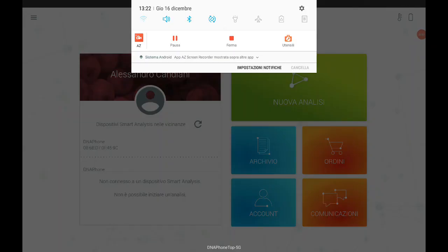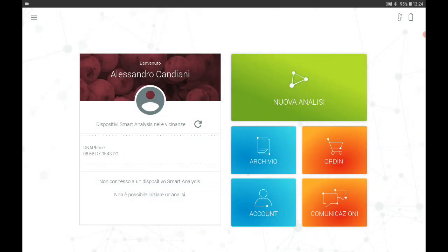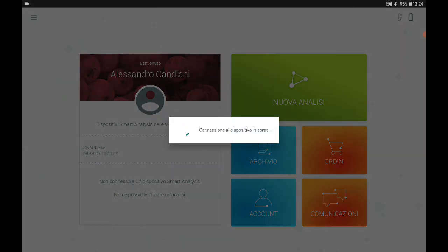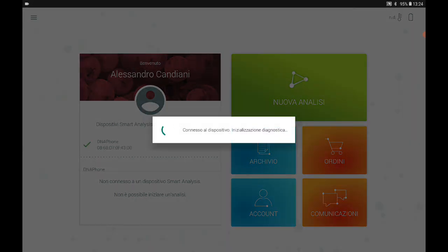Go back to the tablet on the app and the first thing we recommend is to turn off the Wi-Fi and click on the arrow next to the words 'Smart Analysis device nearby.' When you click on the arrow you will see that the app starts to search for the Smart Analysis device. A code appears underneath which represents your instrument — click on the code and give the OK for the Bluetooth connection.